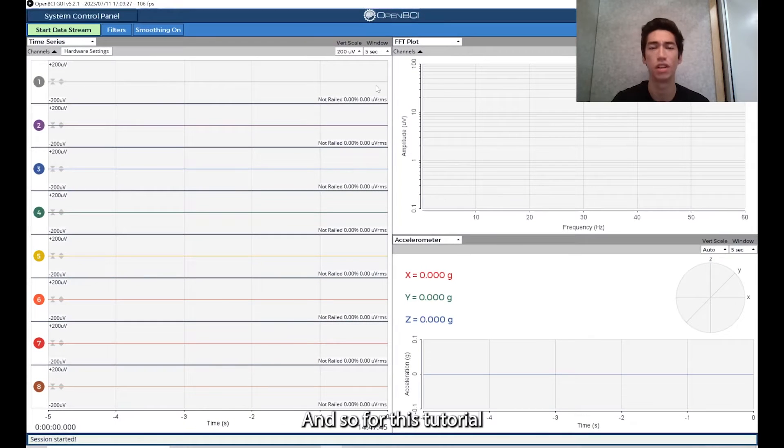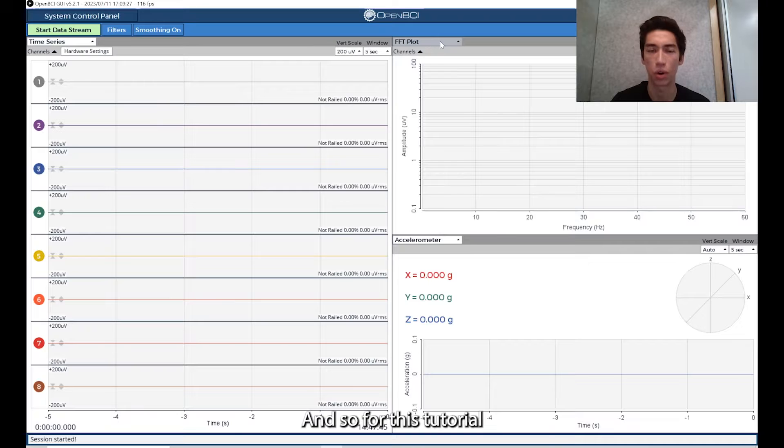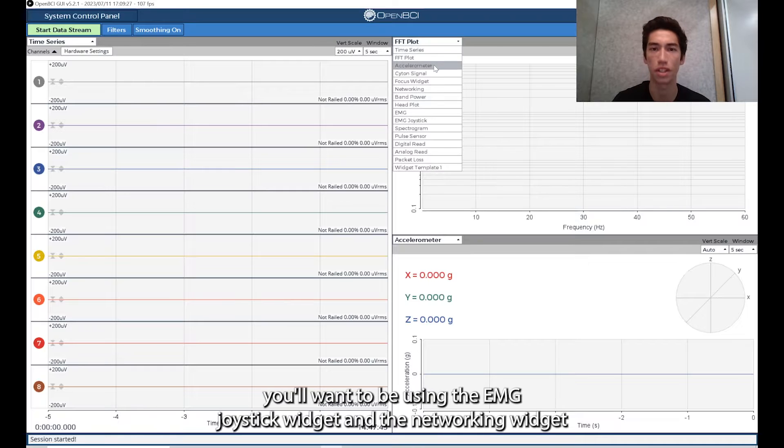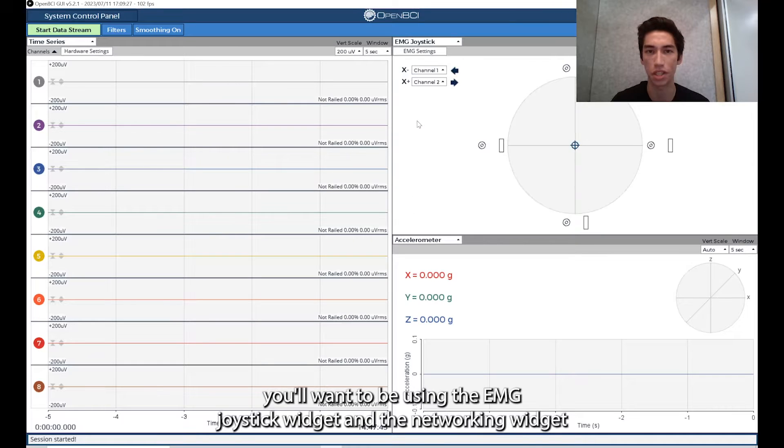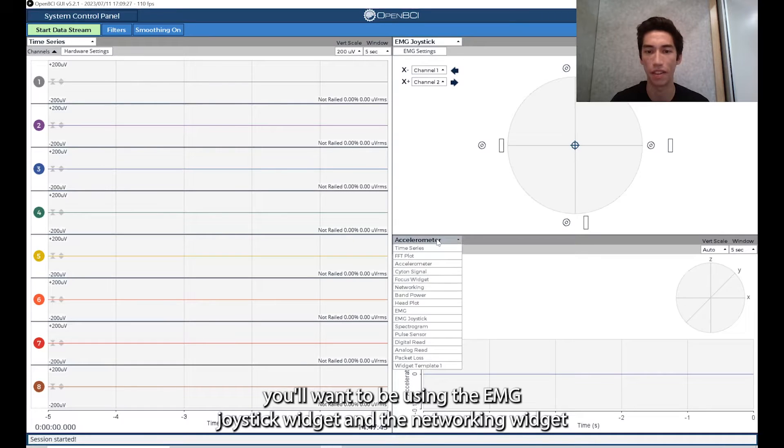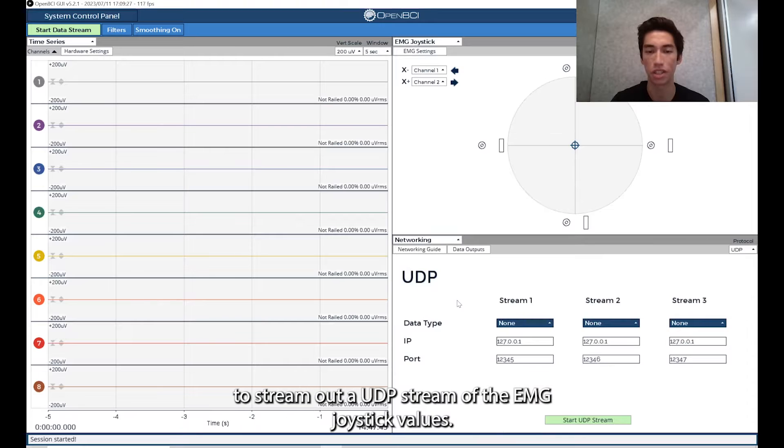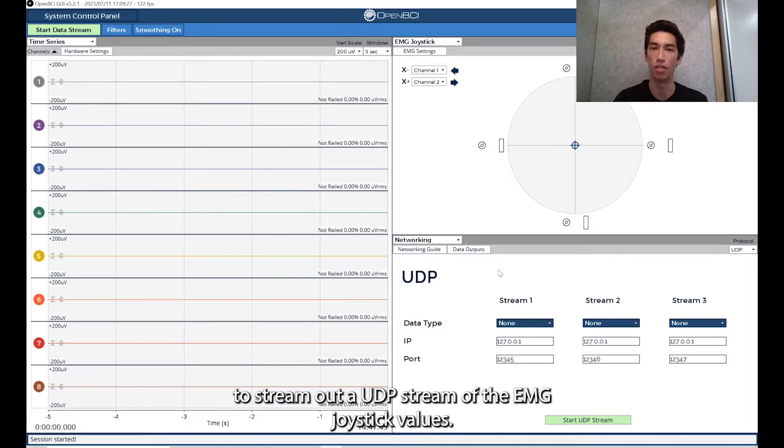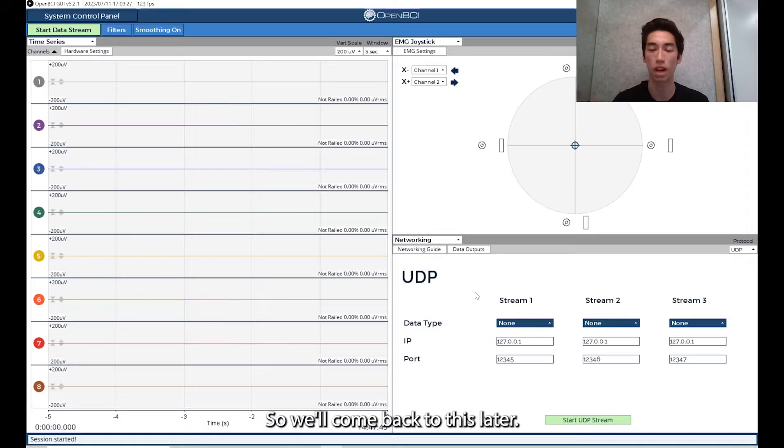For this tutorial, you'll want to be using the EMG joystick widget and the networking widget to stream out a UDP stream of the EMG joystick values. We'll come back to this later.